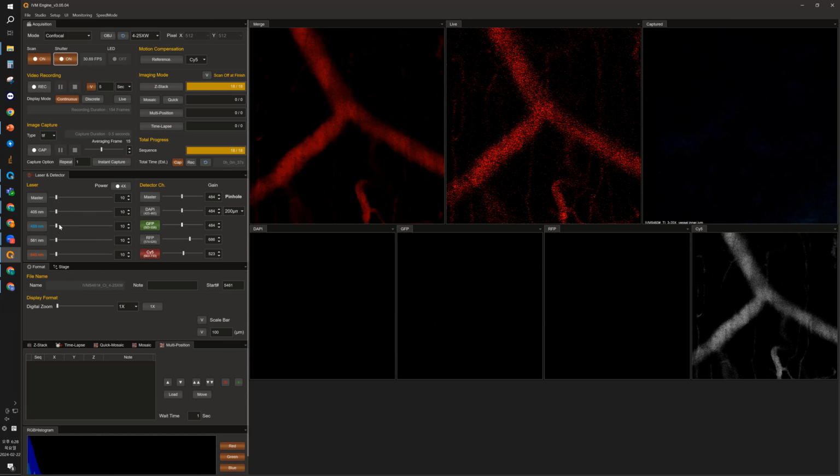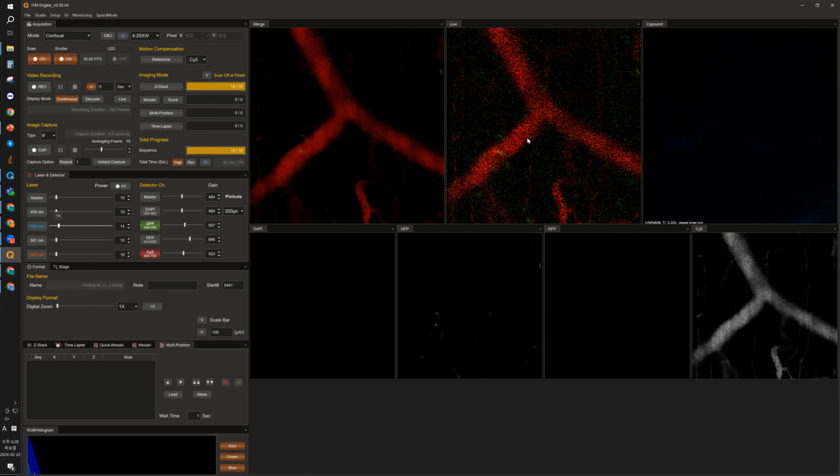Those large blood vessels like this on the screen, with several branches along with the small vasculature, may seem to be good spots to mark and take a signal from.